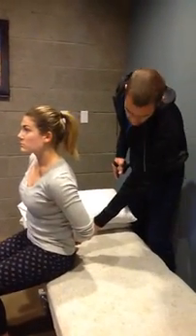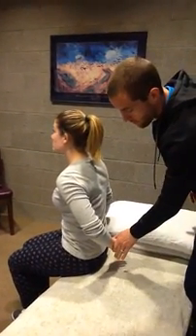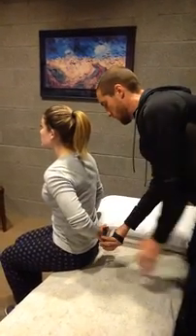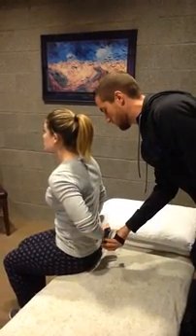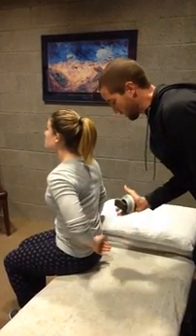The next one we're going to do is subscap. So she's going to put this hand behind her back. I might have you come on over to the side here just so you can see what we're doing. Just to normalize it, we're going to put her hand on her sacrum, or basically the base of her low back. She's going to pull her hand off her back. I'm going to put the dynamometer on her wrist and push in. Hold your arm right here. Don't let me move you. Don't let me push into your back. Hold, hold, hold, hold, and relax.